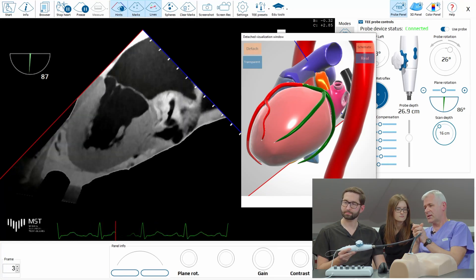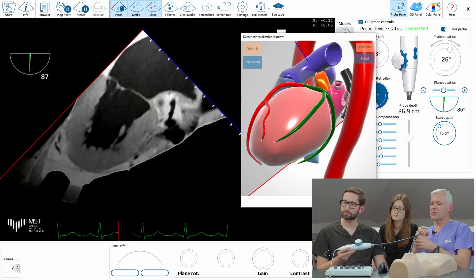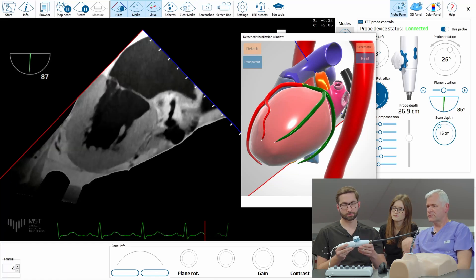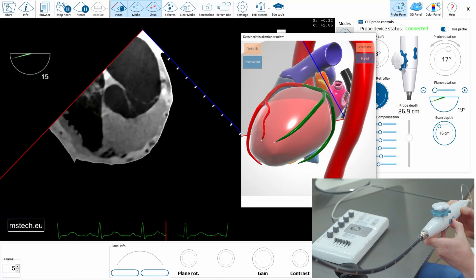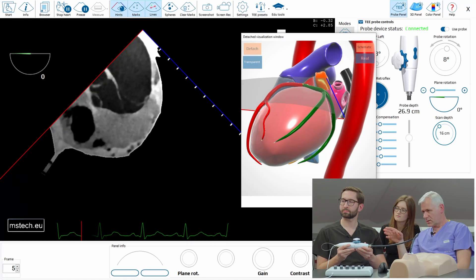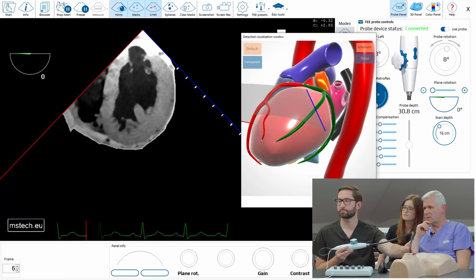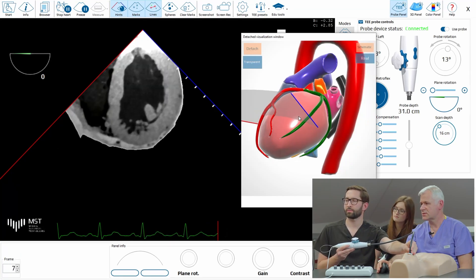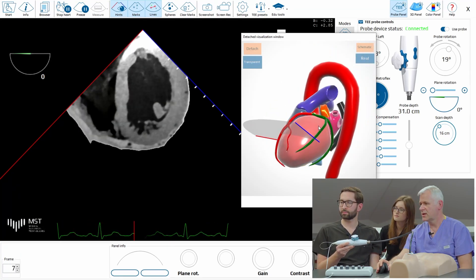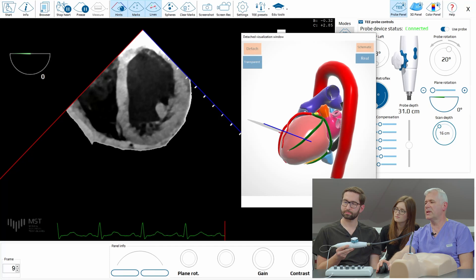And now we can perhaps move to transgastric. Let's go to zero now and go deeper in the esophagus. Here is the current position and orientation of the plane.